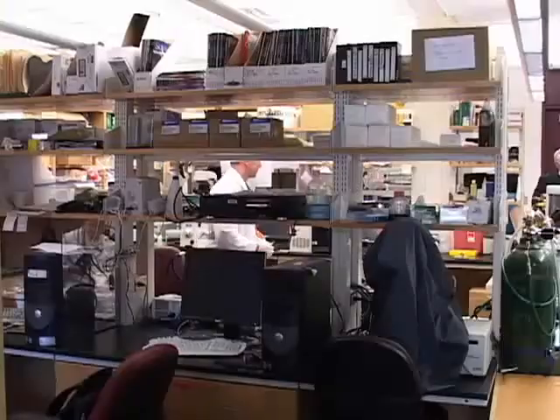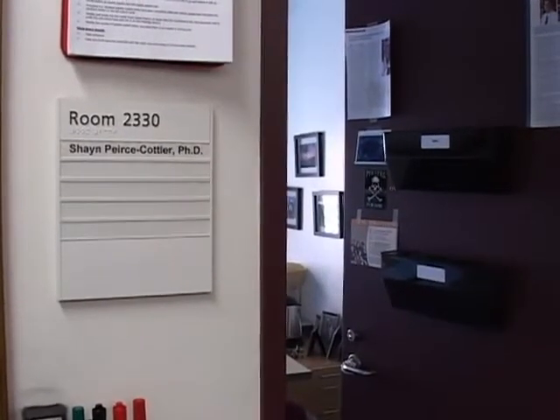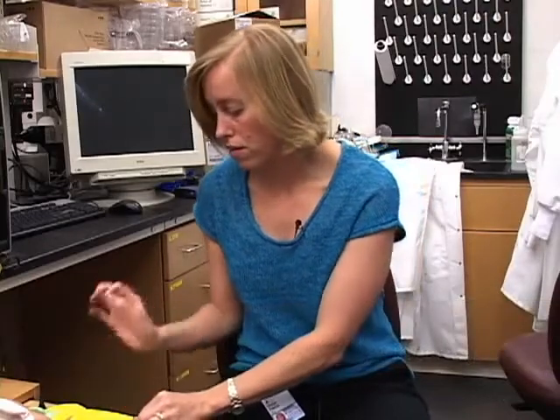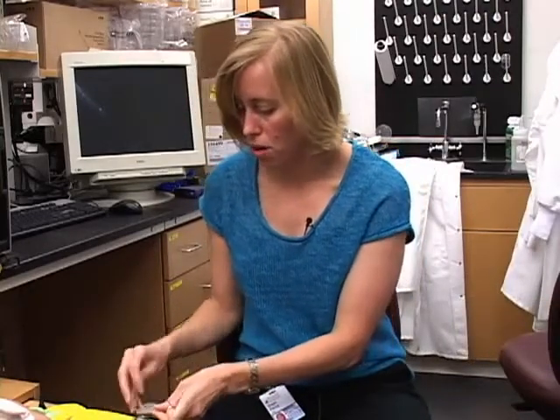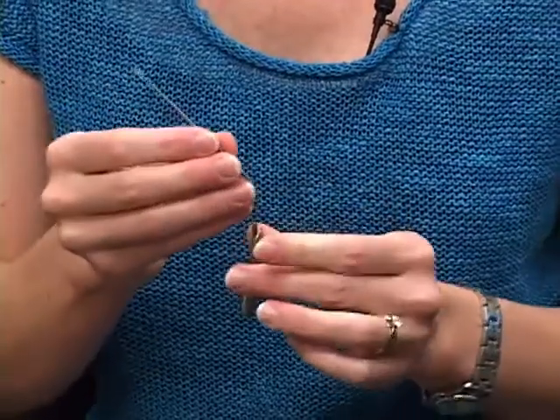Shayn Peirce-Cottler, assistant professor in UVA's Department of Biomedical Engineering, explains how the new ear tube insertion device significantly decreases the time in surgery. We've basically reduced the procedure to needing to make the incision first with a myringotomy blade, so we didn't incorporate that aspect. But then, in one fell swoop, using our device, we can insert the ear tube, provide the suction, both before and after, and seat the ear tube into the incision site, just with one pass. So it basically cuts the total procedure time down by half, and this is what we've validated in small animal testing as well as currently now in our clinical trial.